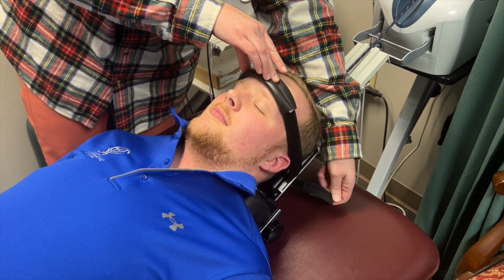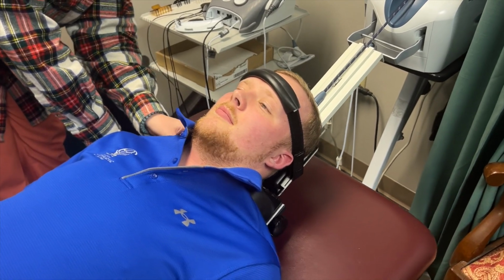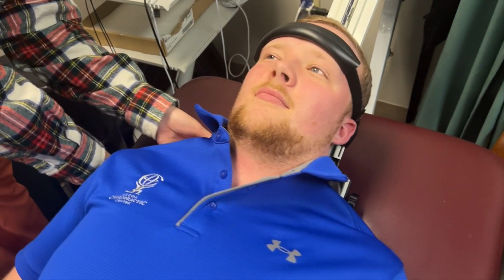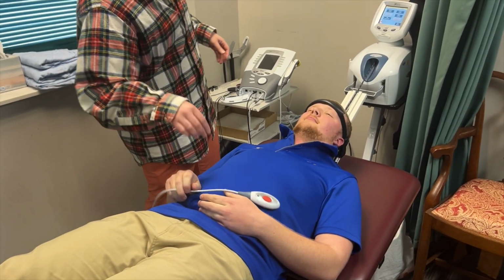Each time we do it, we get more and more accomplished because we're slowly trying to make a correction to something that has made its way in the wrong direction. When it comes to a bad disc bulge that we're treating, it can be as many as 20 to 25 visits if we're looking to truly correct a disc issue. When it comes to facet inflammation, it doesn't require nearly as many, but it can take some time. And if it's a significant disc issue, it can take 20 plus visits to truly get correction there.